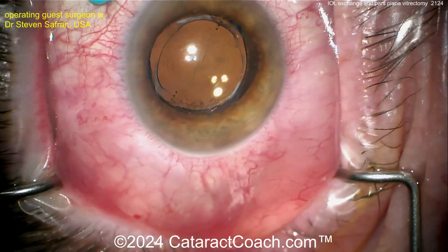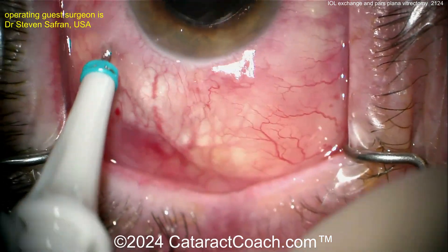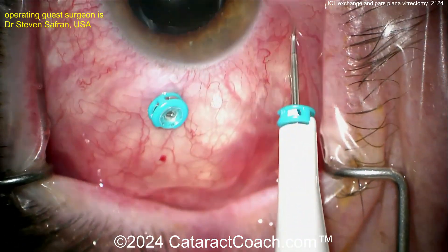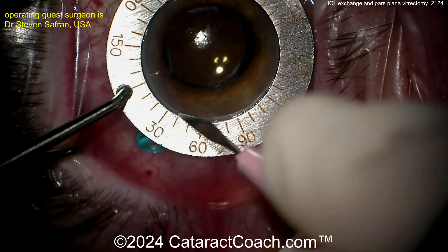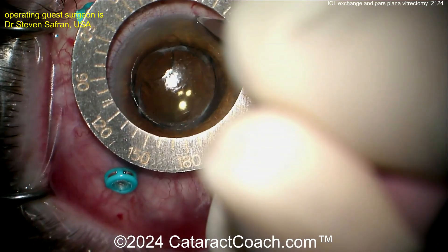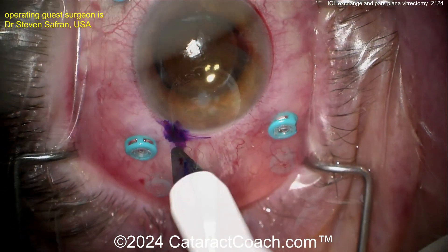On his podcast he was mentioning about all these cases he's doing, especially cases like this where patients have a tremendous amount of vitreous debris and floaters, vitreous syneresis, plus the patients are just unhappy with the multifocal lens. He calls these patients multifocal misery. Now it's not to say you can't be very happy with a multifocal lens — I have many patients in my practice who are thrilled with one. So that's not the issue here.